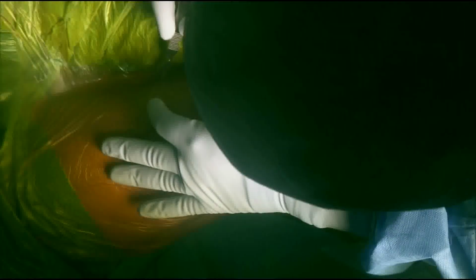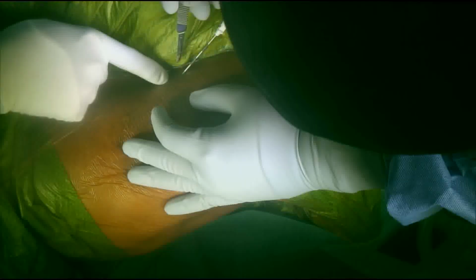In preparation for inserting the catheter, you're going to do a standard approach, centralizing around the needle entry, but slightly more cranial. And you're going to go down to the fascia and through the fascia, and this would help once the catheter is inserted for your fixation to the deep fascia.